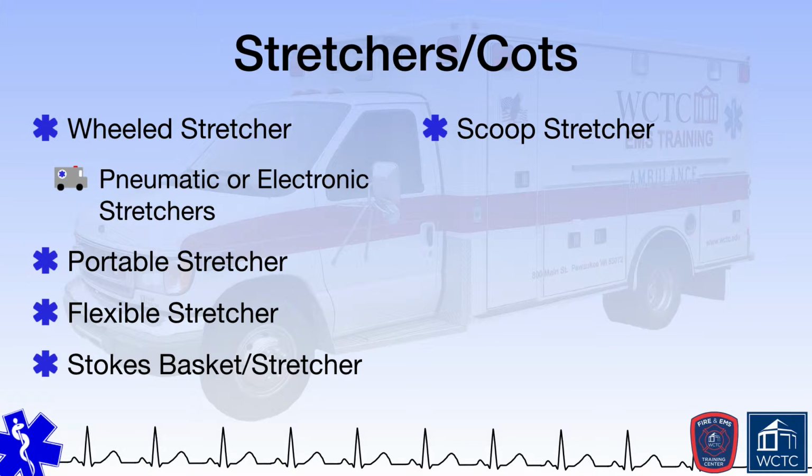If you need to move a very large, obese patient, a traditional wheeled stretcher may not be adequate as wheeled stretchers are relatively narrow, which can be a tipping hazard when the stretcher is elevated, and they are also rated to carry patients only up to a certain weight. To address the need of moving large, obese patients, some EMS agencies have bariatric stretchers that are designed to accommodate both the extra width and weight of these patients. We will discuss bariatric patient movement and transport considerations in greater depth a little later in this module.